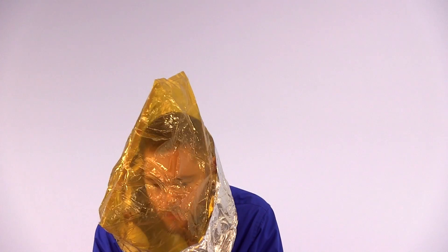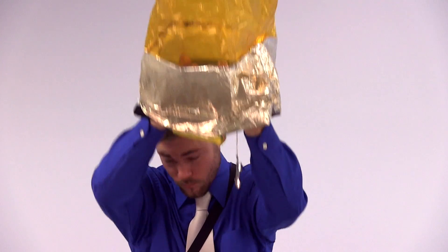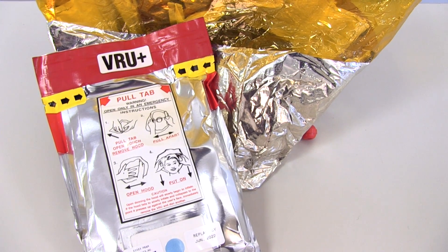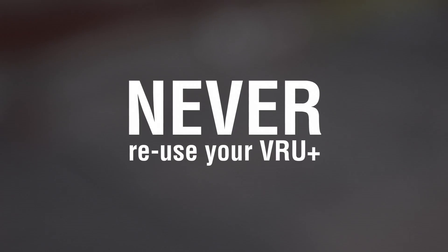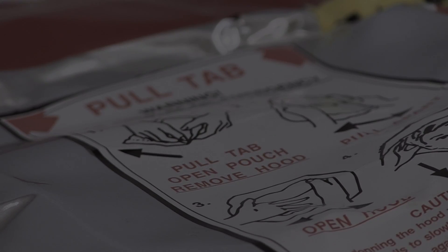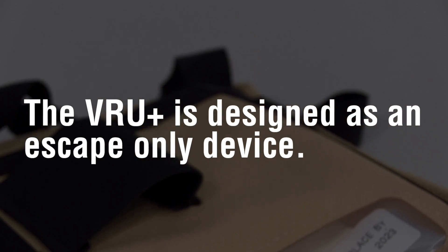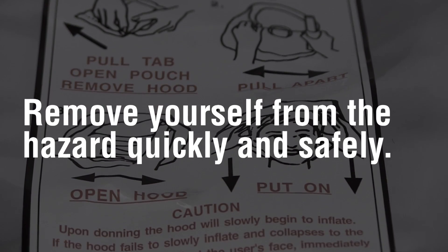When the hood begins to deflate and collapses to the point it starts to contact your face, your oxygen level is depleting and you must find a safe area to remove your hood and don a new one, if necessary. Never reuse your VRU Plus under any circumstance. It is important to note that the VRU Plus is designed as an escape-only device, so remove yourself from the hazard as quickly and safely as possible and seek shelter.